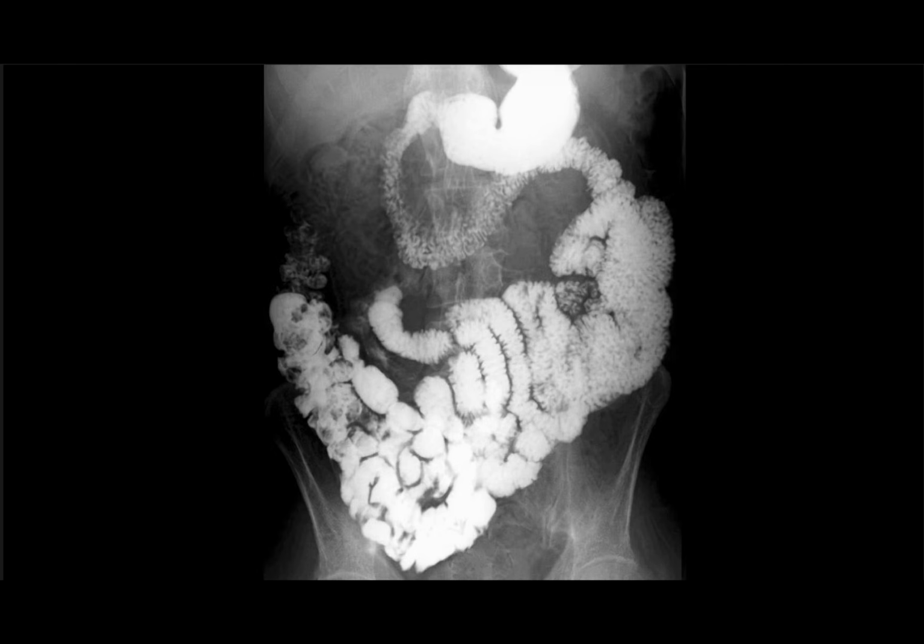Today we are going to look at a barium follow-through radiograph. A barium follow-through radiograph is a contrast radiographic study of the small intestine. It is very similar to the barium meal and the barium swallow because it makes use of the same contrast, which is barium sulfate, and then it has the same route of administration of the contrast.